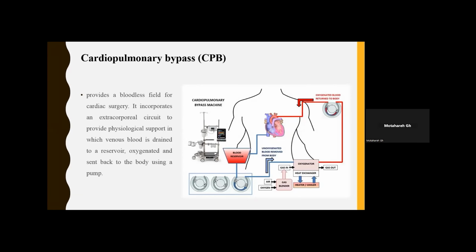of cardiopulmonary bypass. That's a technique in which a machine temporarily takes over the function of the heart and lung during surgery, maintaining the circulation of blood and oxygen to the body. This step includes adding oxygen to your blood, removing carbon dioxide from your blood, and pumping this blood into your body. The abnormal physiology of cardiopulmonary bypass includes hemodilution, hypothermia, complement activation, and depression of immune mechanism.